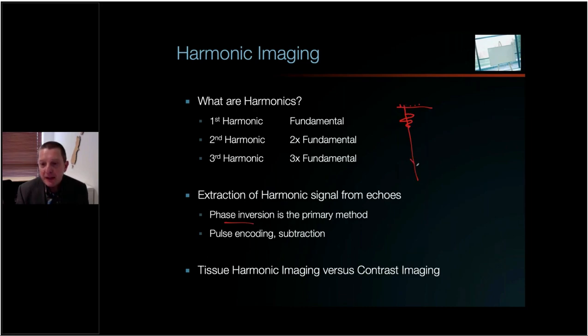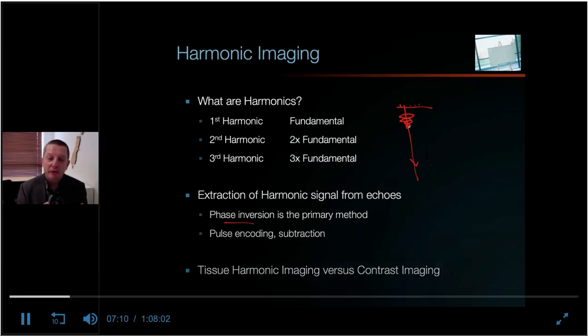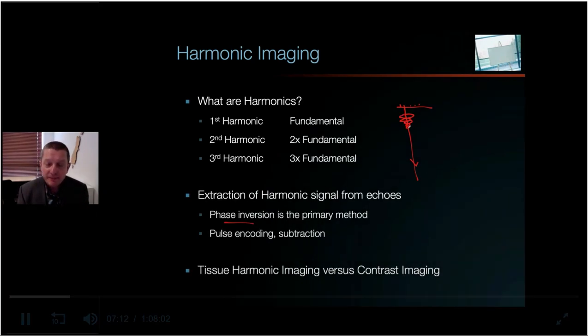This pulse will propagate into the tissues, echoes will return back to the transducer, and then will be held in the receiver. And the next pulse is sent along the same scan line, but this pulse will be opposite in polarity. Where there was compression, there is now rarefaction. So the two pulses along the same line are out of phase, they are opposites.